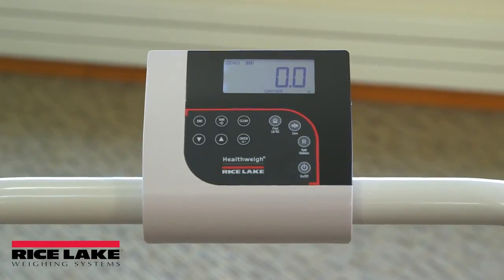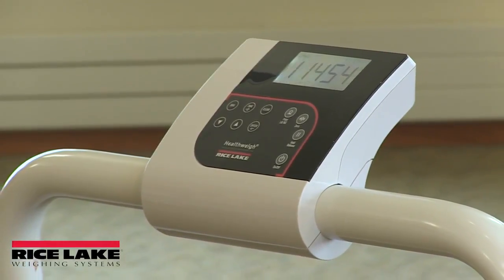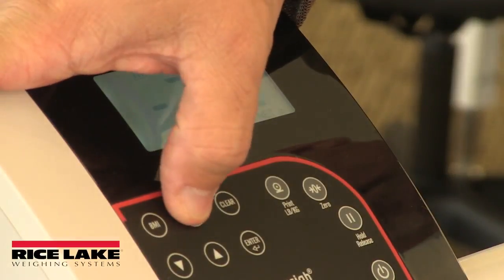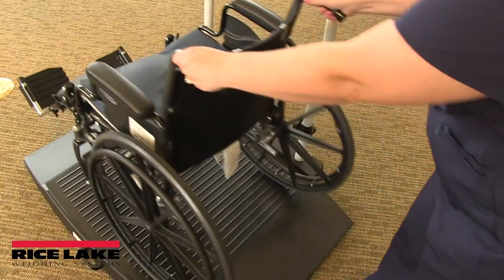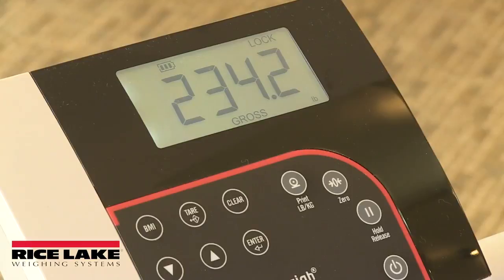Front panel display keys include zero and tare. Zero clears the weight displayed on the scale, returning it to zero, while tare is used to subtract the weight of additional items such as oxygen tanks, IV bags, or other equipment from the scale to pinpoint only the weight of the patient.